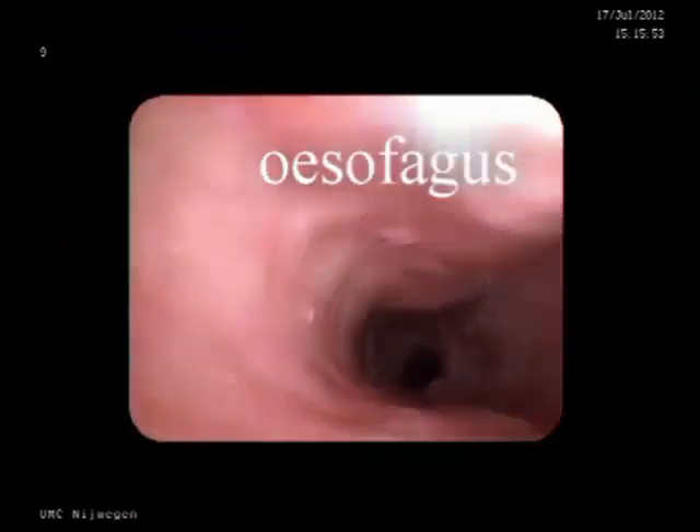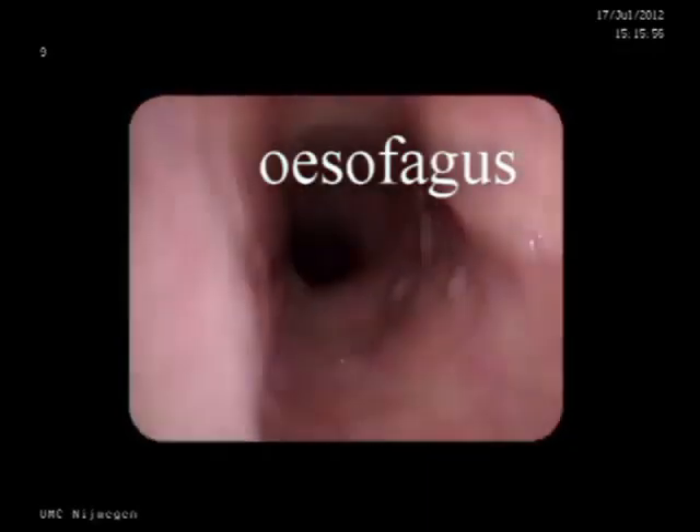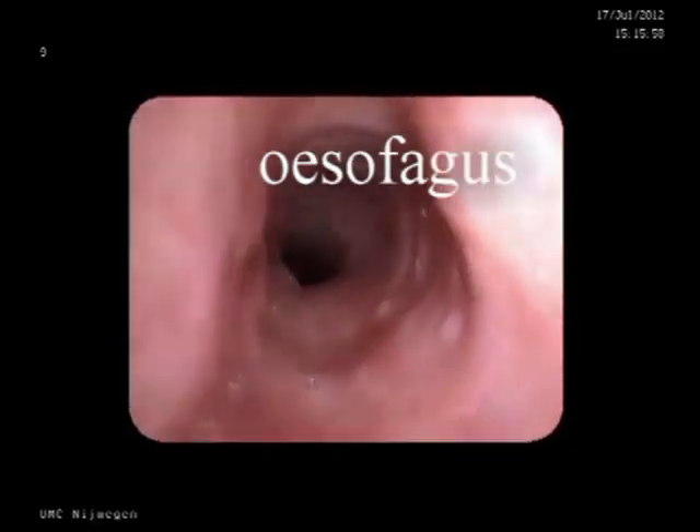By moving the tip of the endoscope in the piriform sinus posteriorly and letting the patient swallow, the esophagus can be examined. With the introduction of digital endoscopes with a working channel, transnasal esophagoscopy is possible by blowing air through the esophagus.